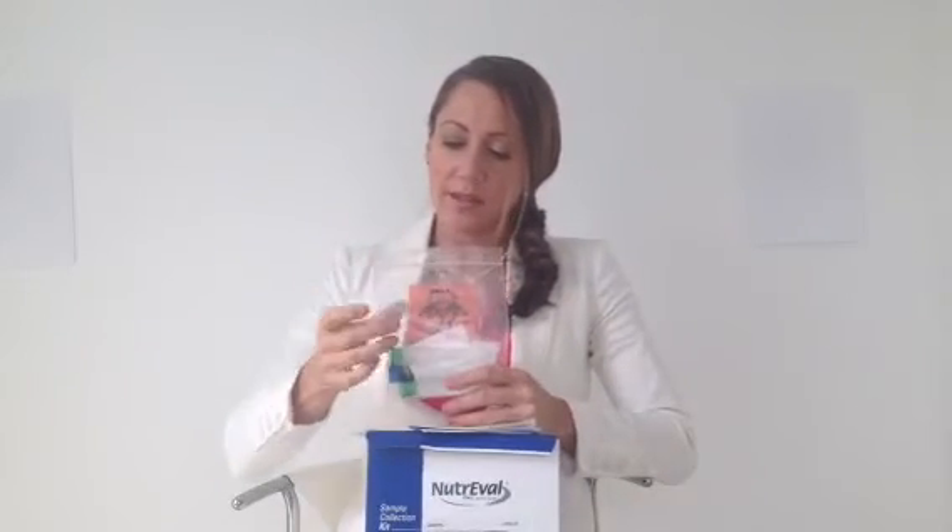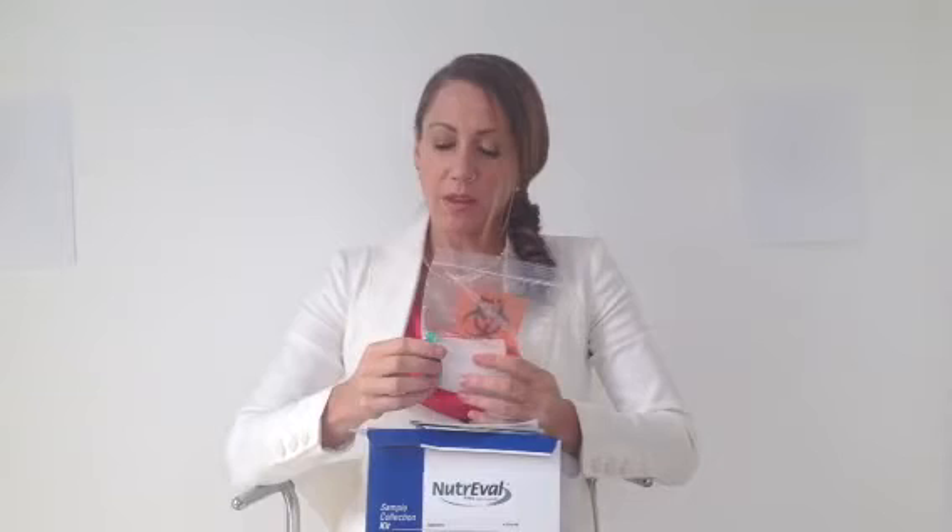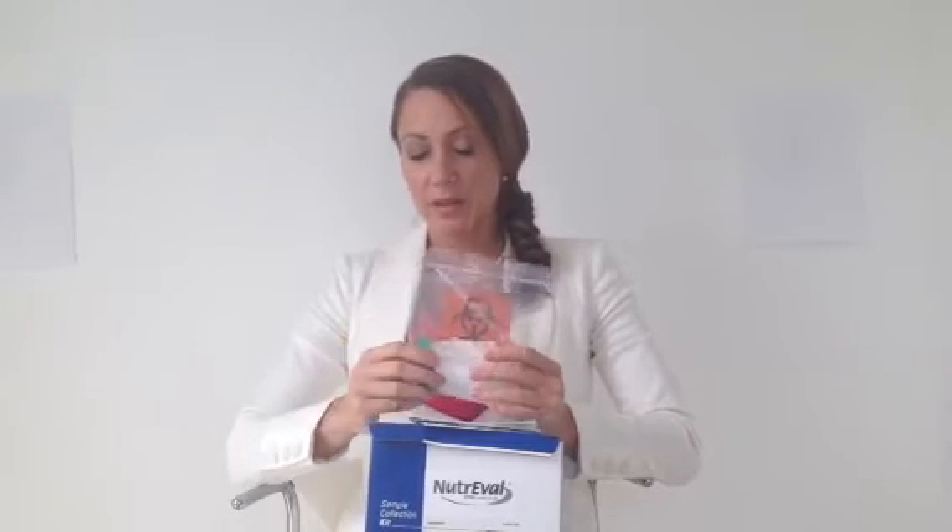You'll find three different vials in the kit for your urine, along with a small dropper to transfer the urine from your cup into the containers. Place everything back into the bag and fill in the required information — your name, the date, and so on.